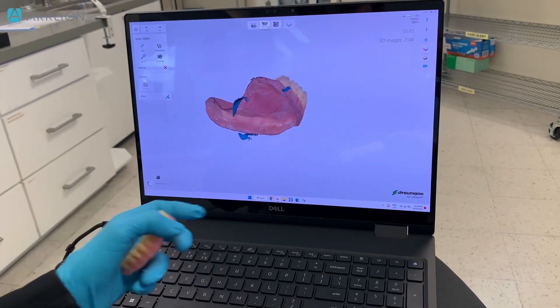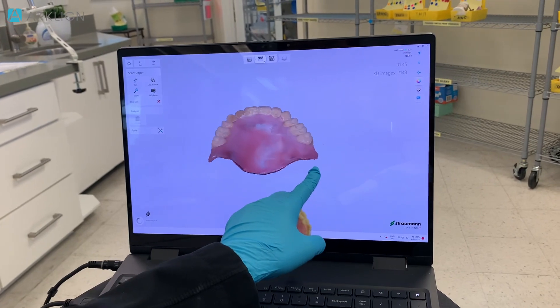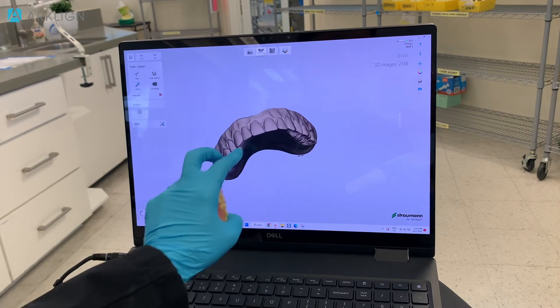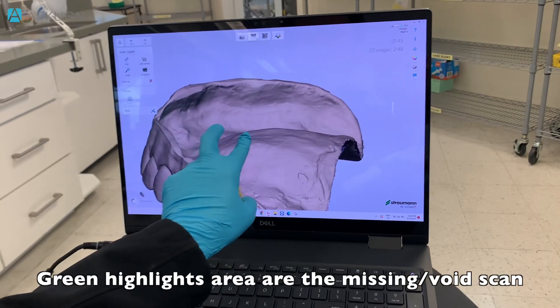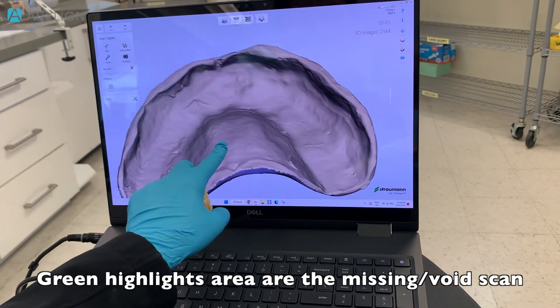We're going to stop and take a look at our scan. You can also click into monochrome mode — this is what we look at most of the time. You want to make sure you can inspect the scan to see if there's any voids or any missing area. If there's anything missing, it's going to be highlighted in green.